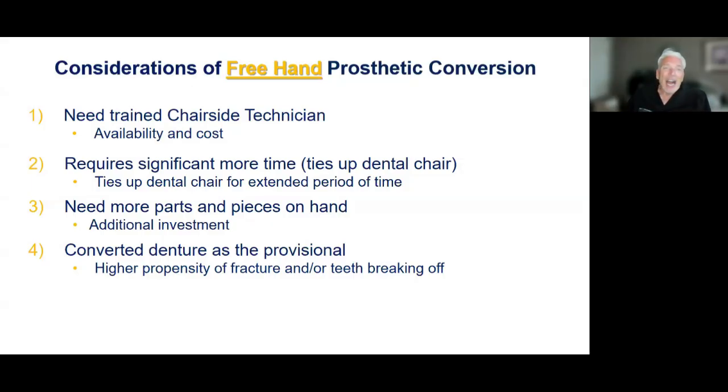But either way, you have to have a trained technician to help you if you're going to do that. So that could be additional costs. More time ties up your chair, of course. More parts and pieces. You need to have backup things. And the converted denture is not as strong as what we're able to print for you these days.